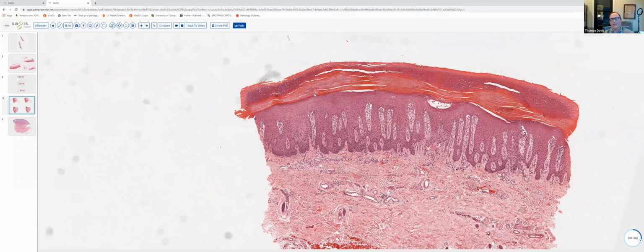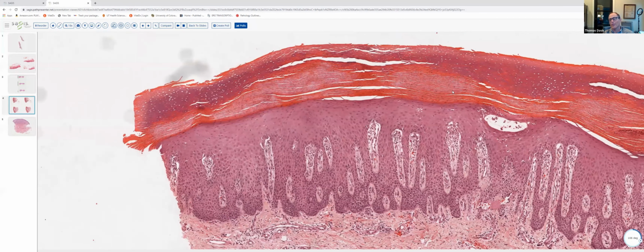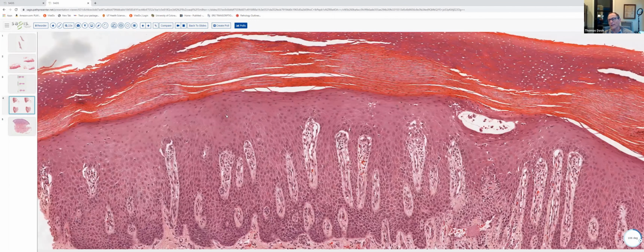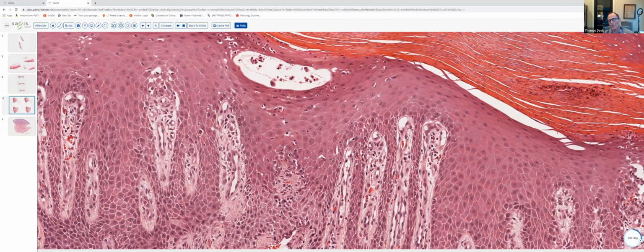There is, again, extensive parakeratosis containing neutrophils within the stratum corneum. The granular layer is absent. There are a few spongiform pustules within the epidermis. The suprapapillary plates in many areas are quite thin. There are dilated and tortuous vessels present within the underlying dermis, some closely approximating the undersurface of the thinned dermal papillae.